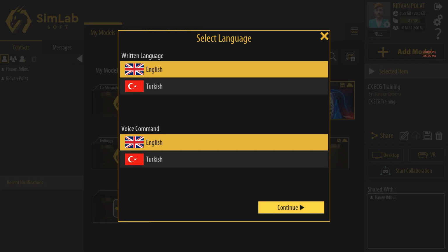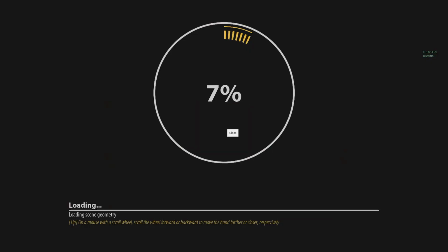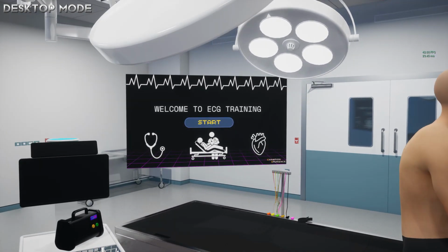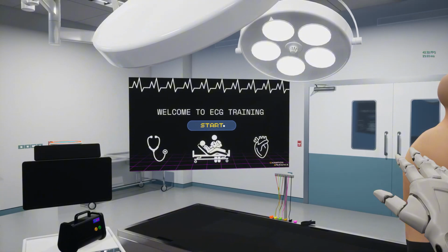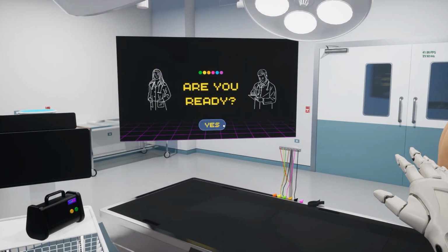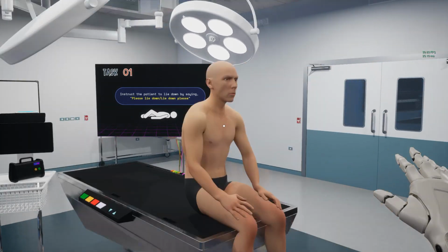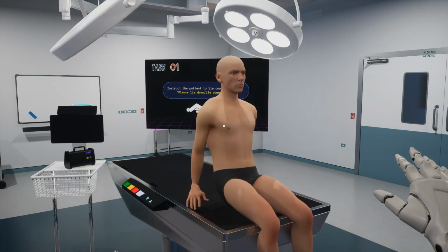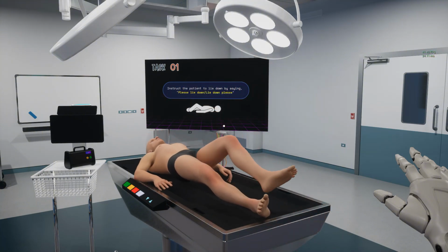Welcome to ECG Training. In this training, we explain all the steps you need to do on the interactive training screen in Turkish or English. You can guide the patient with voice command support. Lie down, please. When the command is received, the patient will switch to the desired position.